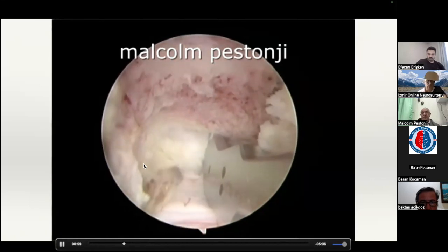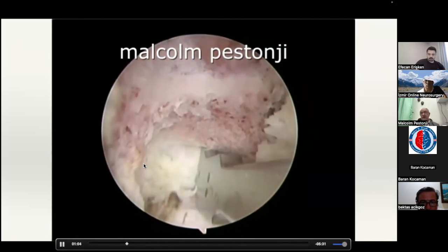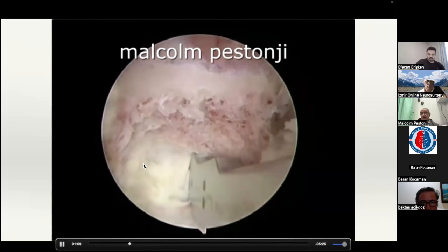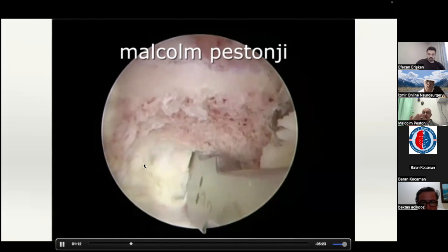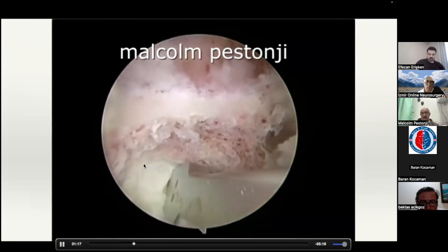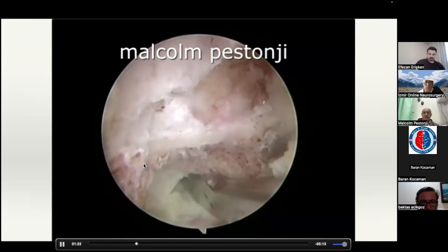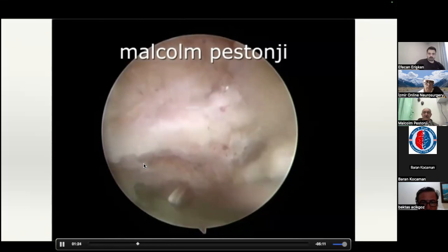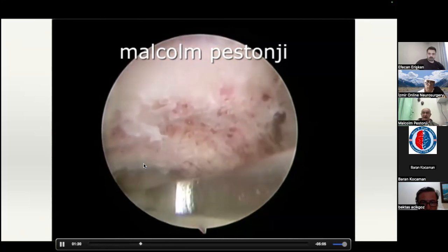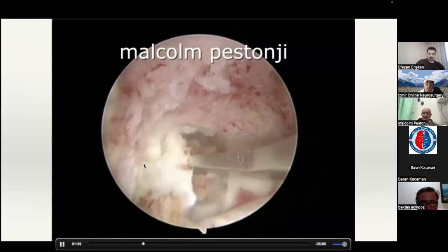And then slowly, now I'm tamping in my J-shaped osteotome, and you can see how I'm fracturing the tip of the superior articular process. And then gradually shifting it until it shifts into the canal. So that is the movement that you have to understand and learn. And slowly, the whole piece will come into the canal. You need to slip on it, glide on it, and then pull it in. You don't need a very sharp osteotome. It has to be pretty blunt, to be very honest.